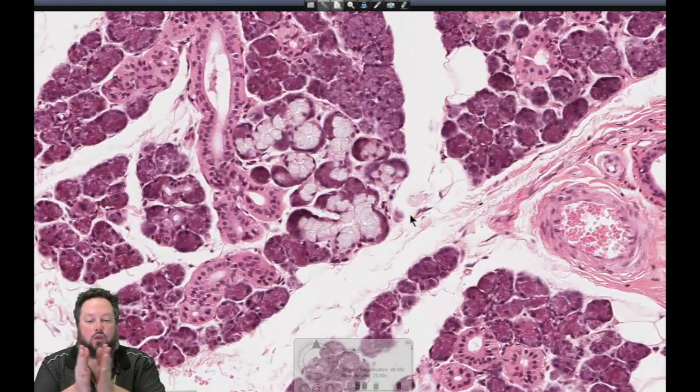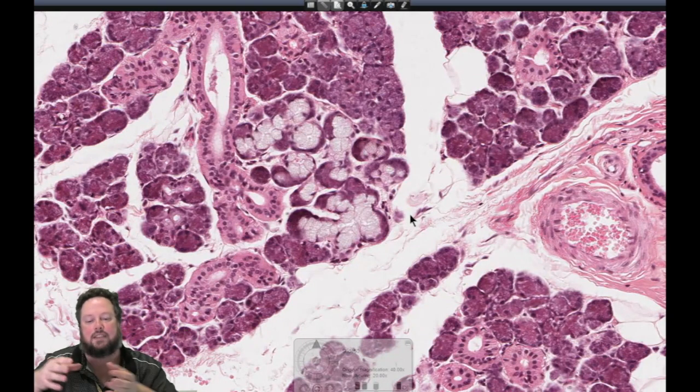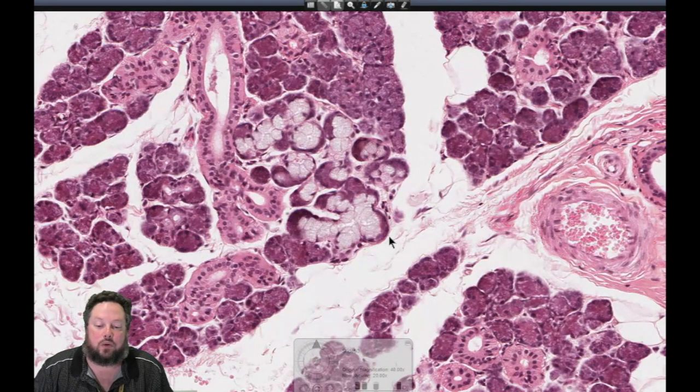Now, they normally sit side by side. You've got a serous cell, a mucus cell, serous cell, mucus cell, not necessarily completely arranged like that. But when we process for microscopy, mucus tends to expand. What it does is it pushes those serous cells out and they form a cap on the surface. And so they form these structures known as serous demilunes. So here's a serous demilune on this mucus acinus end here.